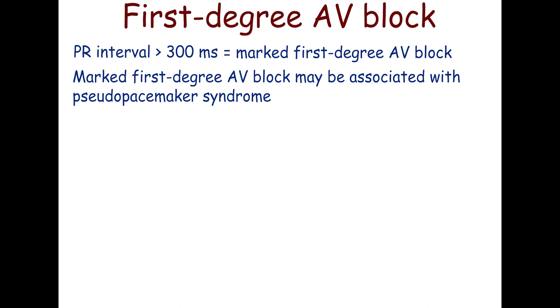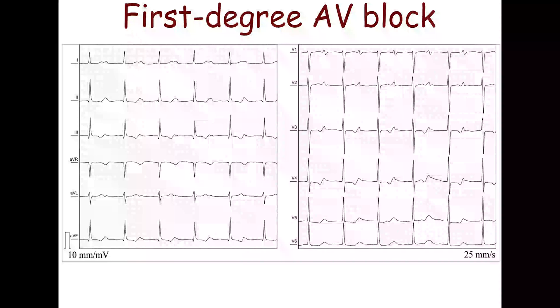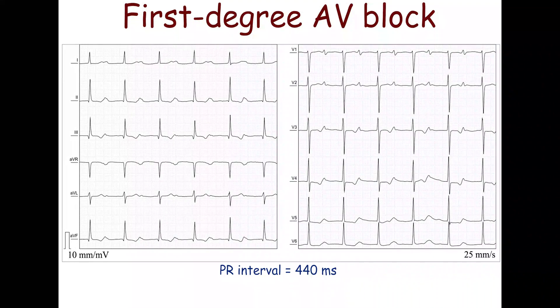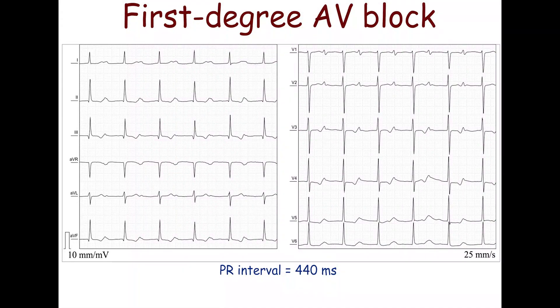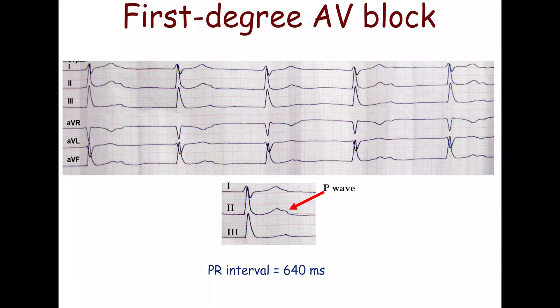Marked first-degree block can lead to pseudopacemaker syndrome, which is characterized by significant asynchrony between atrial and ventricular contractions, resulting in retrograde blood ejection from the atria. This ECG shows an extremely prolonged PR interval of 440 ms, where the P waves merge with the T waves of the previous complex. Another ECG demonstrates a PR interval of 640 ms.